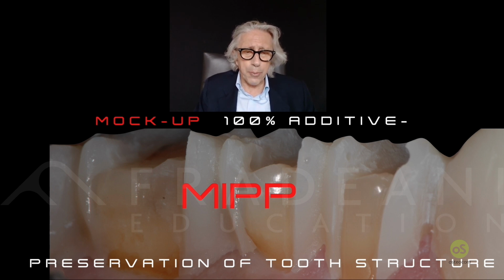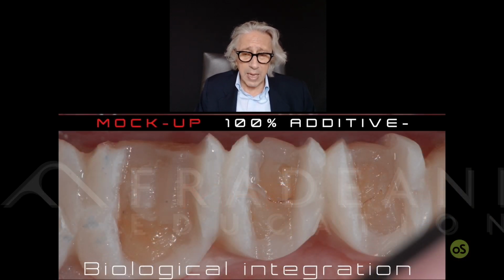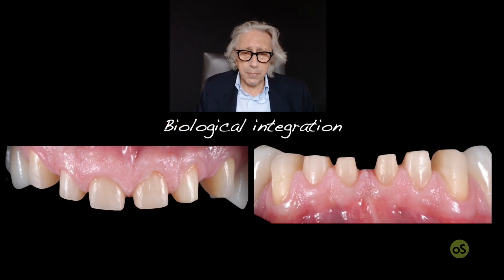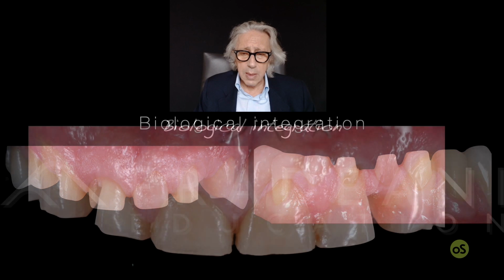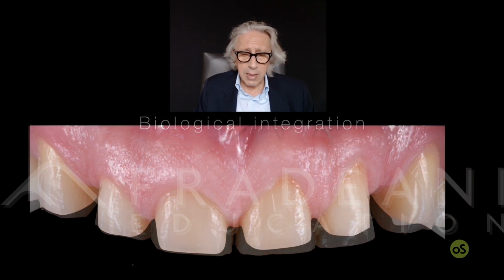You cannot prepare the teeth. The term preparing is something that does not really fit perfectly. In this case, we are refining the teeth with a very light tooth preparation, and you have a lot of space available, so you don't have to cut. You can keep all the enamel that was present before. So we did that also on anteriors, not just on posteriors. And on anteriors, we kept exactly the enamel that was present there. There was not an incredible amount, but still a good amount present.